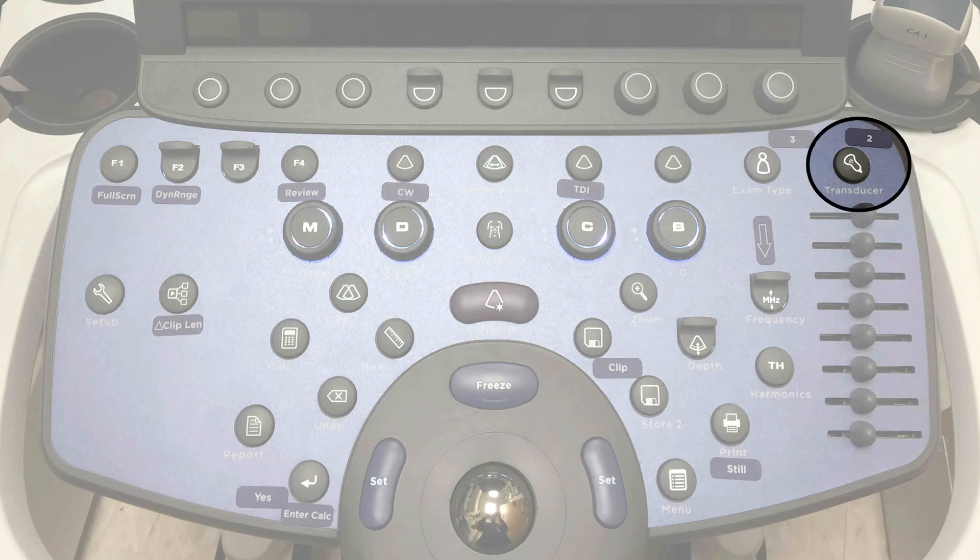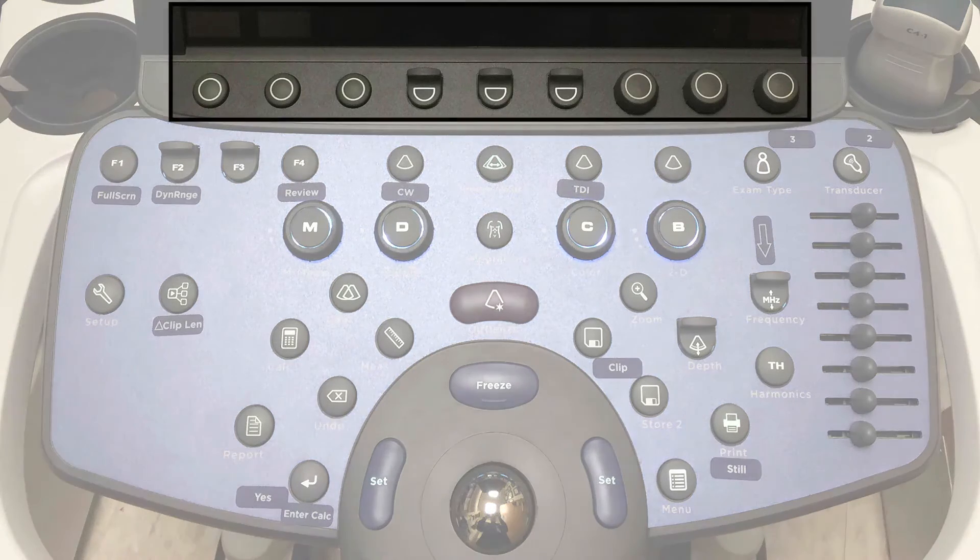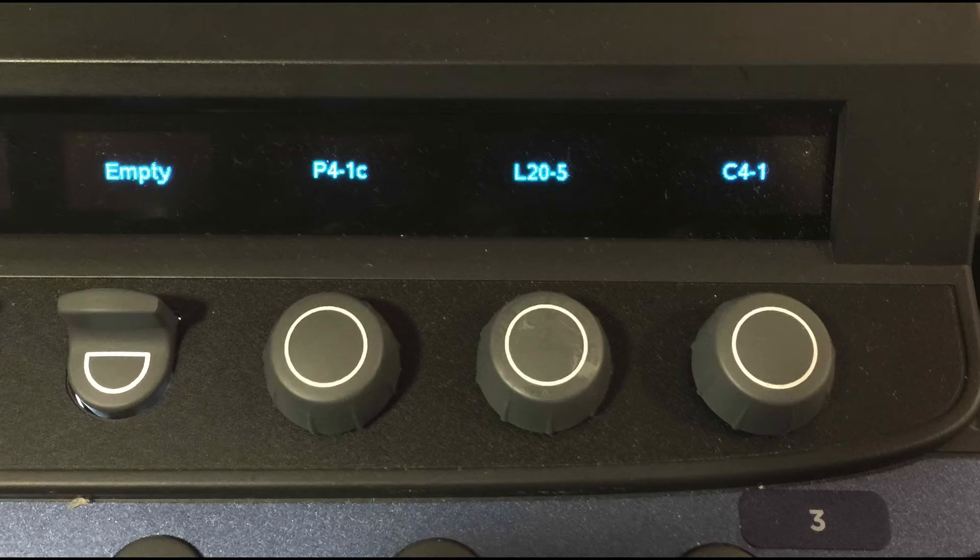you're going to press the transducer button — that's number two. This will allow you to select a transducer, and then you're going to go to the soft keys. The first three dials will list the three probes that are connected: in this case the phased 4-1, the linear 20-5, and the curved 4-1.